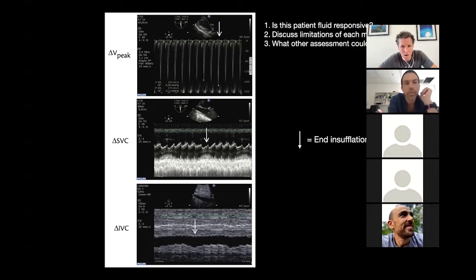Well, that tells me that there's stroke volume variation, but it doesn't necessarily tell me the patient's fluid responsive because they're not ventilated at more than 8 mLs per kilo tidal volume. Excellent, my man. Okay, so we'll come back to that for Vishal's part. So he's only at 6 mLs per kilogram ideal body weight ventilation. So that's good. Okay, what about the next one?